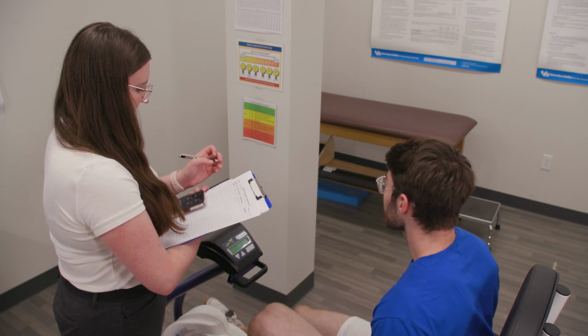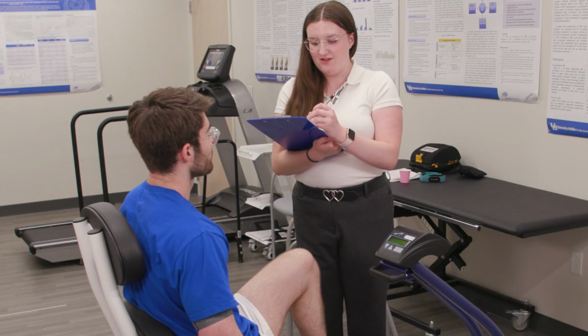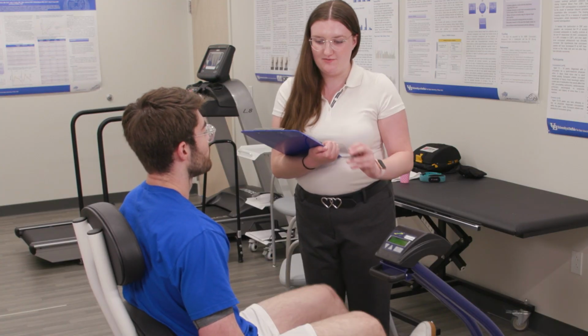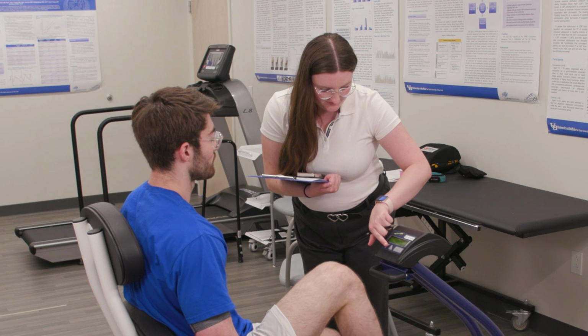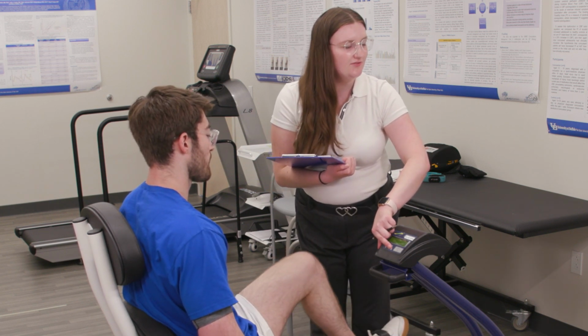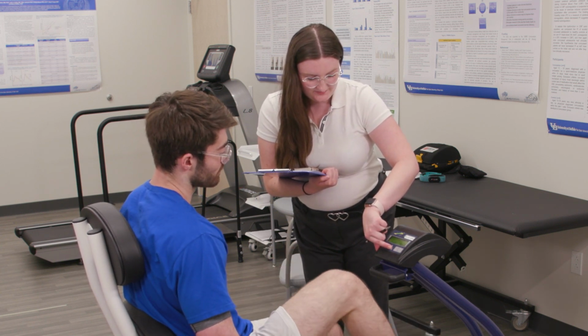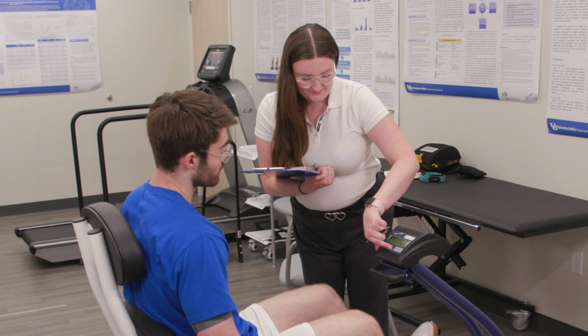The examiner should also record general observations as the test progresses. Changes to the VAS ratings should be specifically clarified and noted. For example, if the rating moves from 2 to 3, it should be clarified if this reflects the addition of a new symptom and/or increased severity of an existing symptom.